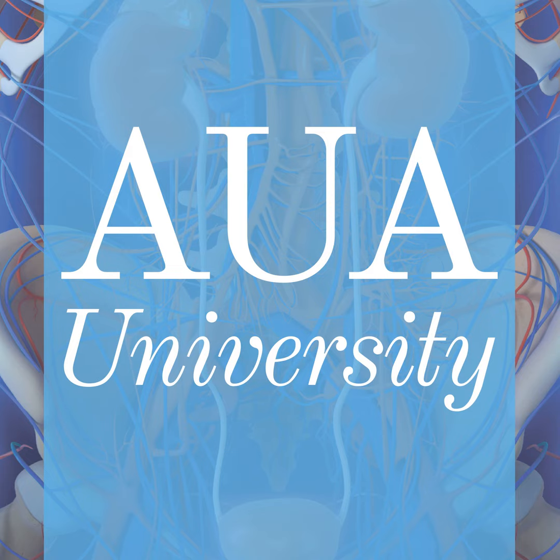As you've seen, the performance accuracy of a PSMA PET scan is highly dependent on the PSA level, especially when it comes to patients with biochemical recurrence, because we have hopefully a pure PSA after the prostate's been removed. One thing that I tell our residents and fellows, if you remember one thing, just remember at a PSA of 0.5, you detect something on the PET scan about 50% of the time. So a take home: 0.5, 50%.